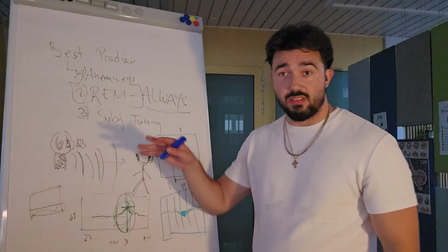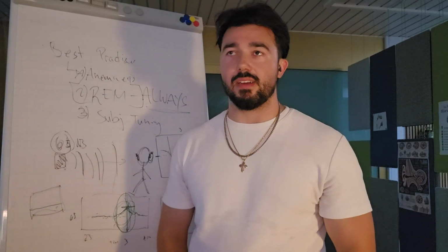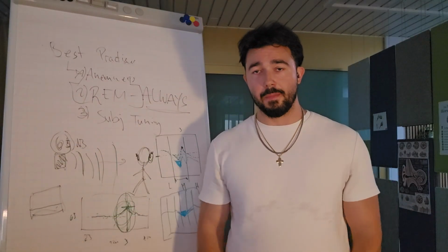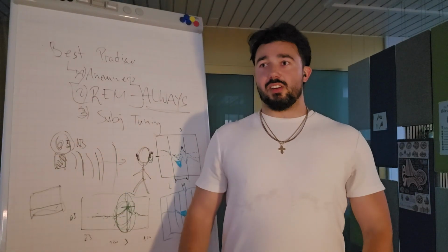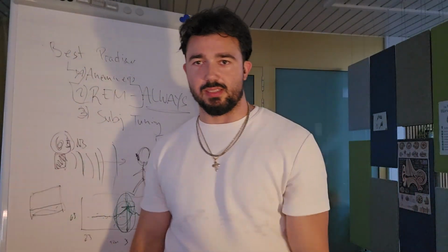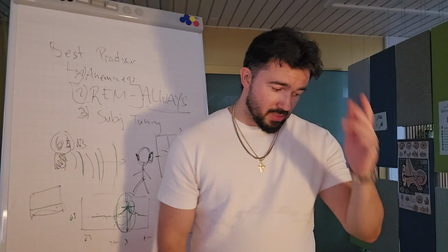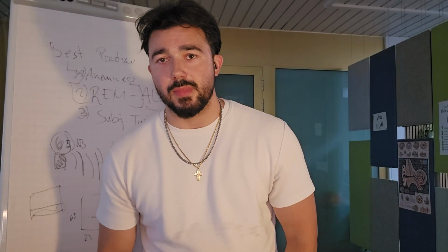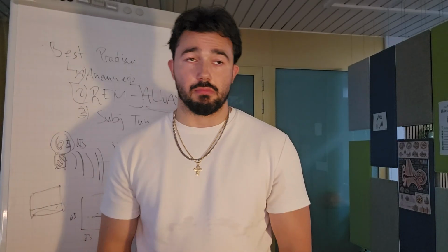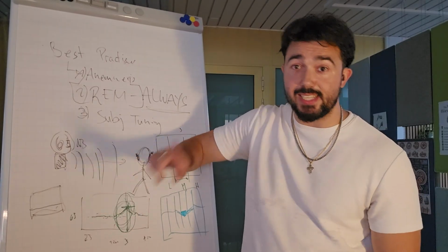This stuff, in equalizers usually only has 3, in some devices more, but in OTCs usually not, right? OTC hearing aids, because it's meant for who? Usually older people that aren't so technical that they can figure out like 20 equalizers, you know. I mean, in America it's a little bit different because you've got a lot of veterans that need those as well. They're younger usually. But anyway, that's that. Better get the cheapest possible real hearing aid these days, right?